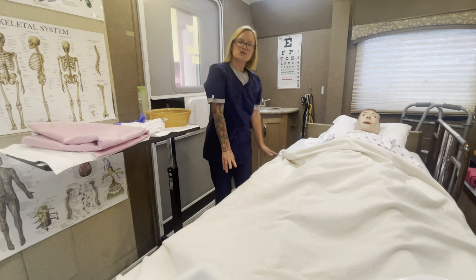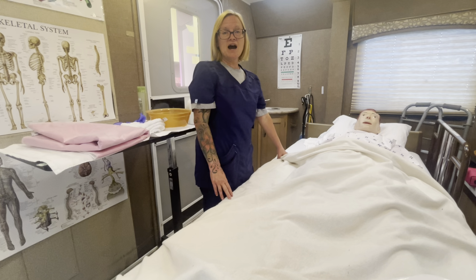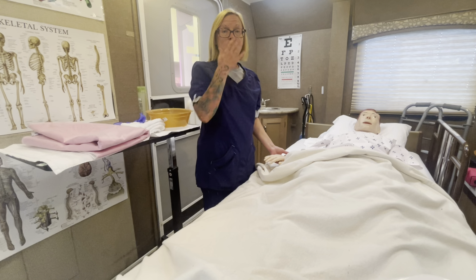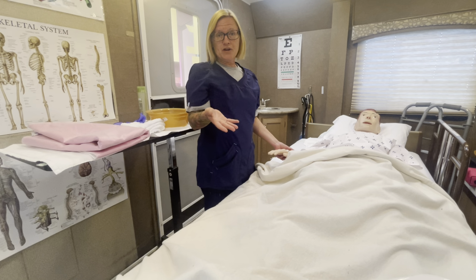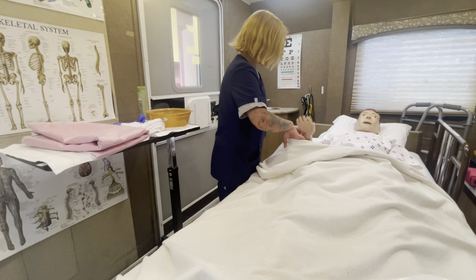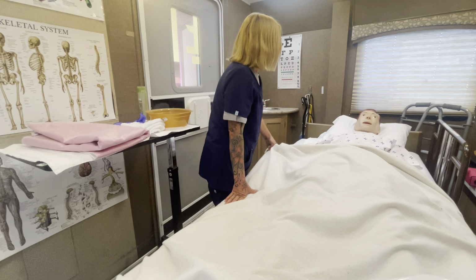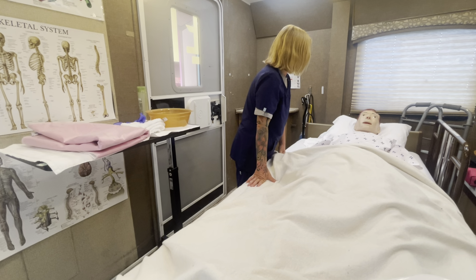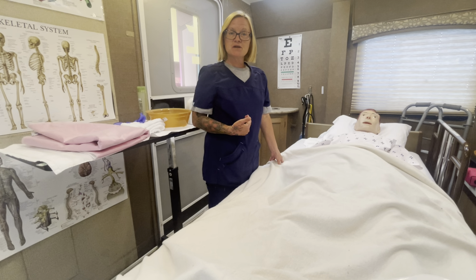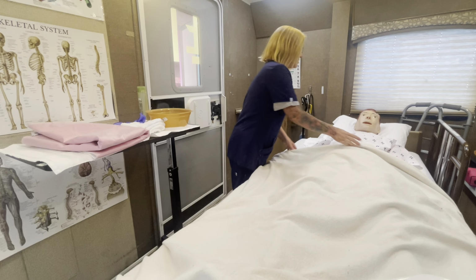The next thing I want to do is identify my patient. We usually use two identifiers. If you're in a hospital, they'll have a wristband. And if you're in a resident home, a nursing home, it'll be in the chart and they'll have a picture of the patient. So you'll say, can you tell me your name and date of birth? He does. And then I'm going to explain the procedure. Mr. Smith, I'd like to perform catheter care today. Would that be okay with you? I'm asking consent because anytime we do any procedure on a patient, we want to make sure that we get consent. All right, patient says it's okay.